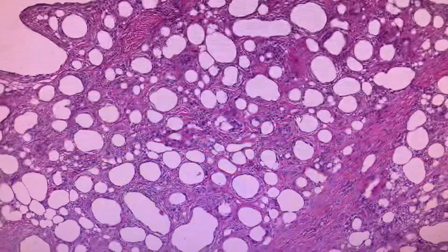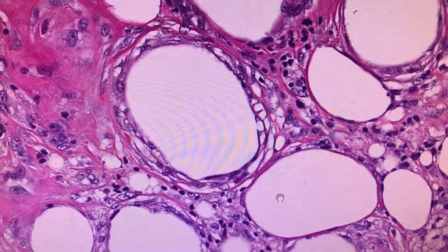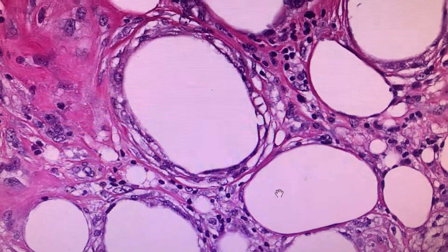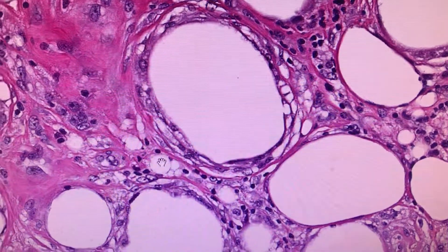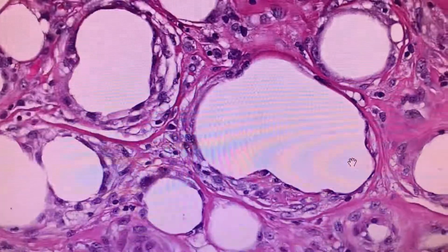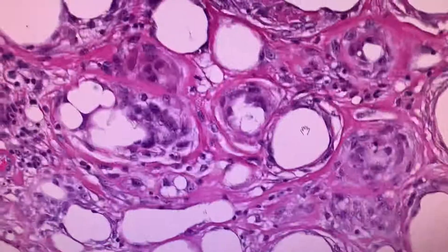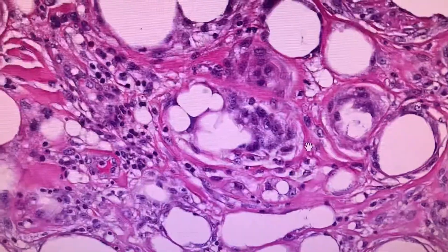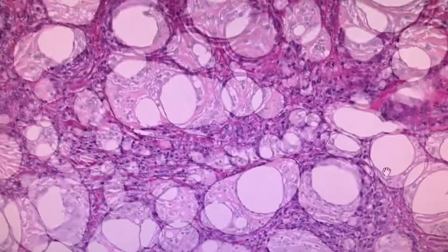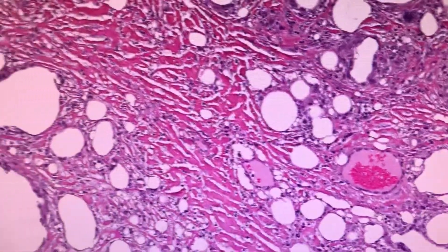I'm going to show you a few other fields — can you tell what's going on here? What is the diagnosis in this case? This is a case of exogenous lipoid pneumonia. These large globules or spaces are essentially fat that's been wiped out of the tissue, leaving these big holes, surrounded by multi-nucleated giant cells and fibrosis in the interstitium. This commonly causes an infiltrate or mass in the lower lobes.